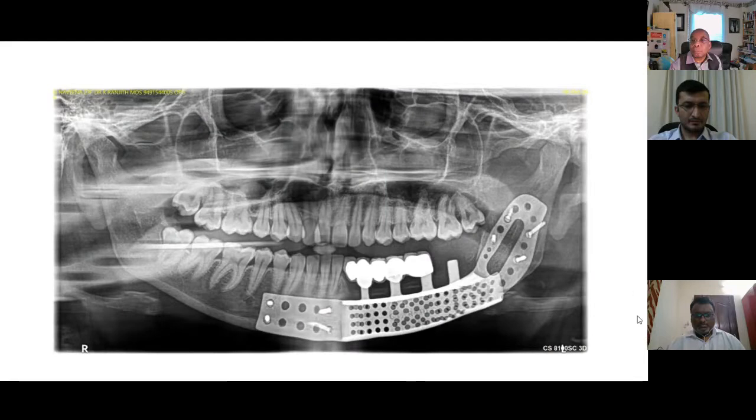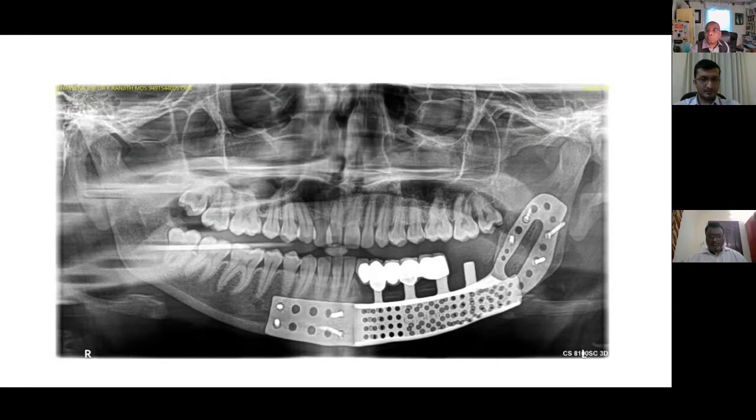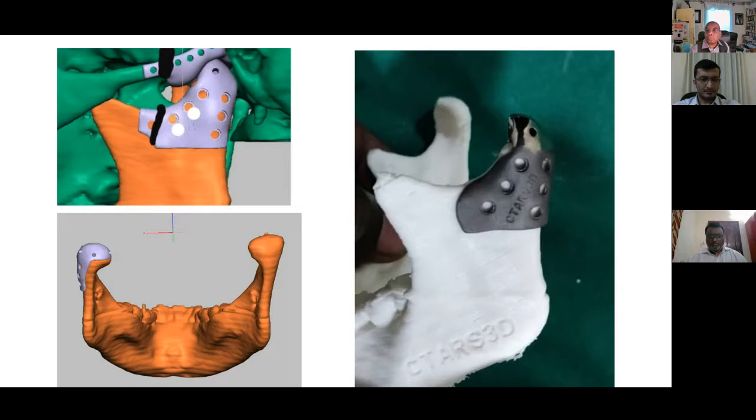This last abutment is purposely still submerged. I don't want to open up that particular area. Anyway, the patient is very happy. She's too young, she got married now, and there is not a single scar on the face. The entire surgery was done intraorally, giving utmost respect to maintaining the integrity of the periosteum. In benign pathologies, I can take this risk.